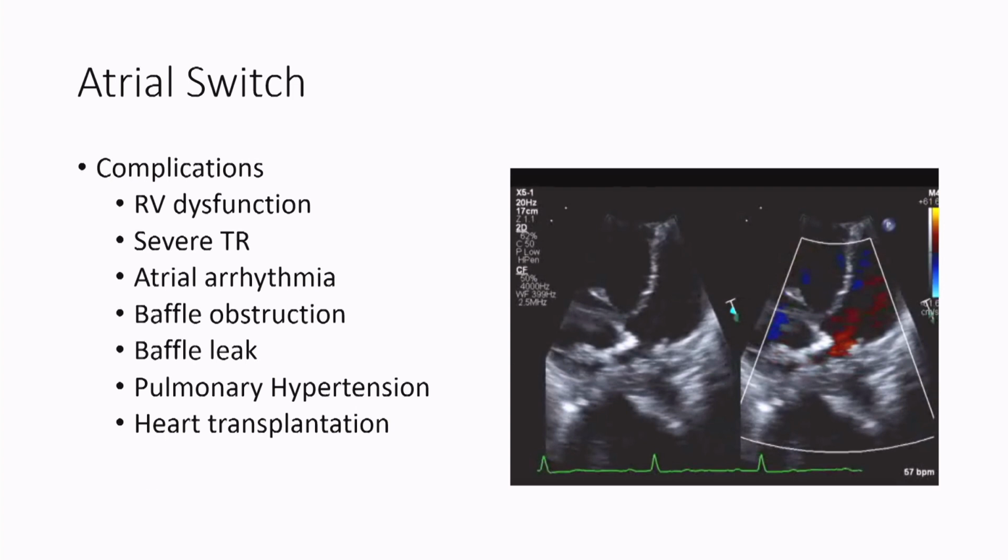And this, of course, is the flow that we know how to evaluate the prosthetic valve.